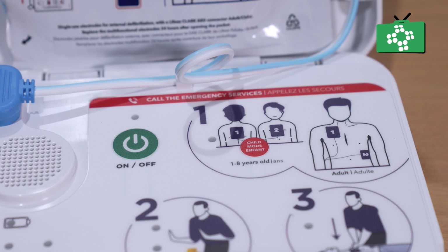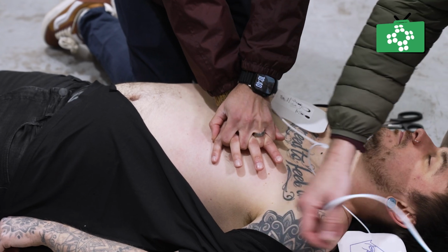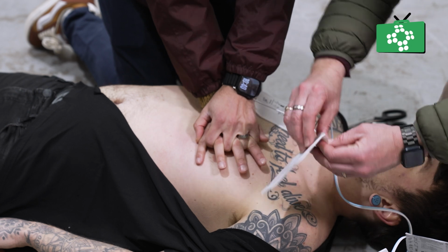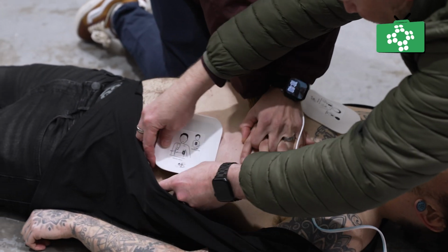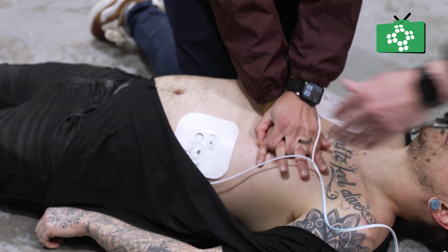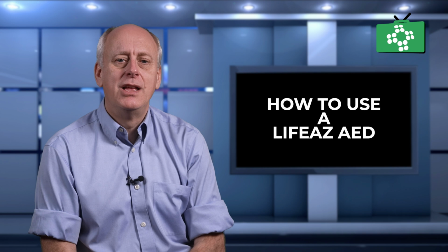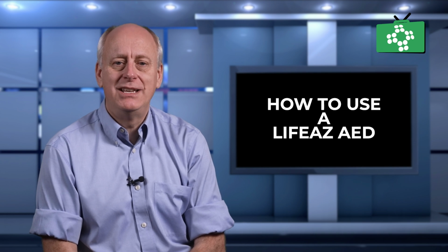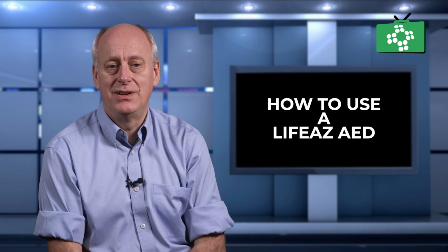Select adult or child configuration by adjusting the settings. One pad goes just below the collarbone on the victim's right side of their chest. The other pad goes under their left armpit on the side of the chest. For infants and children, the pads go on the front and back as shown on the diagram on the pads. Press the pads firmly onto the skin to ensure full contact and allow for effective electrical conduction.